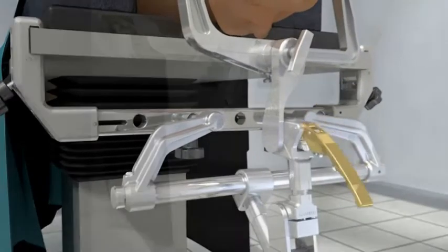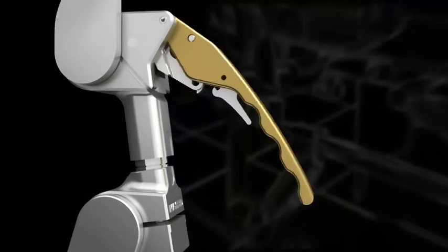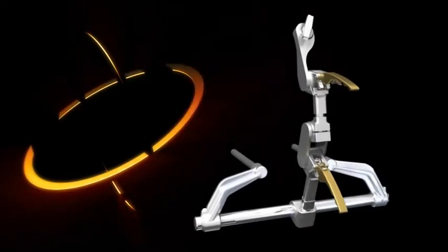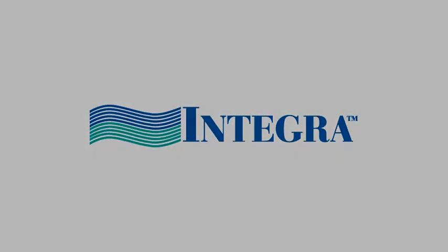The 360 provides easier movement and attachment to the Mayfield skull clamp, faster setup and attachment with just two locking handles, and the added security of self-locking latches on both locking handles. The Ultra 360 is the next generation of Mayfield cranial stabilization equipment, brought to you by Integra.